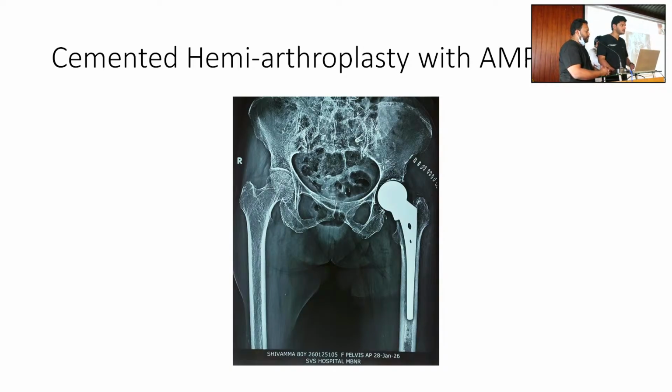Trial is always very difficult to do. But the only thing is once you put it inside, the suction effect is there as it goes inside. That's what gives the exact size.